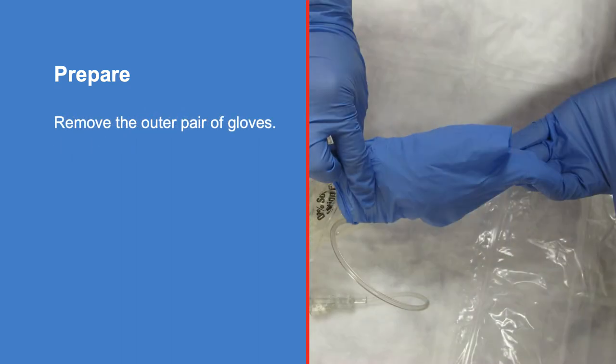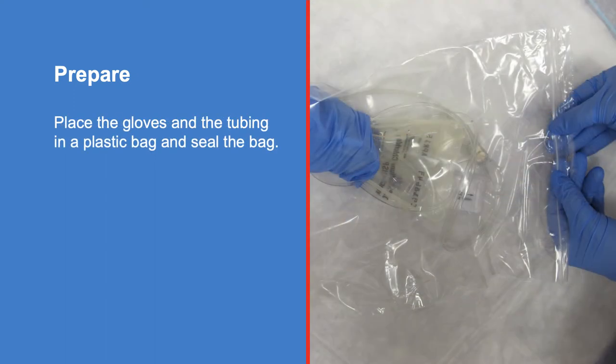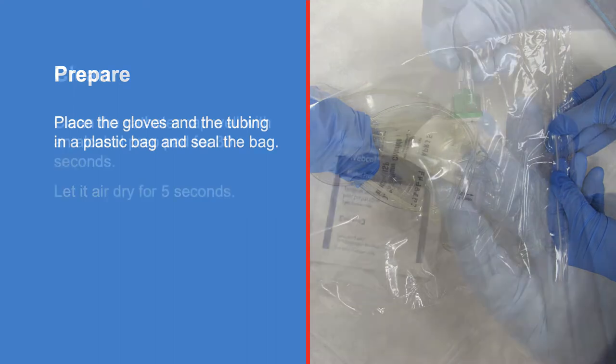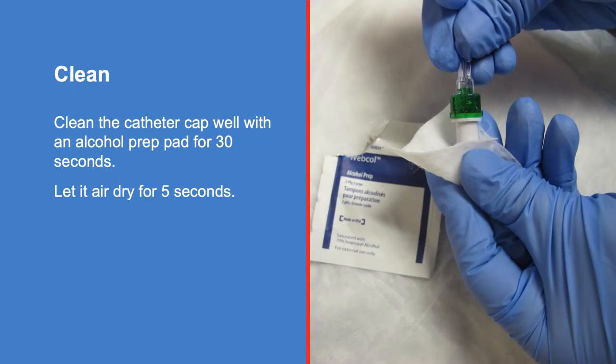Remove the outer pair of gloves. Place the gloves and the tubing in a plastic bag and seal the bag. Clean the catheter cap well with an alcohol prep pad for 30 seconds. Let it air dry for 5 seconds.